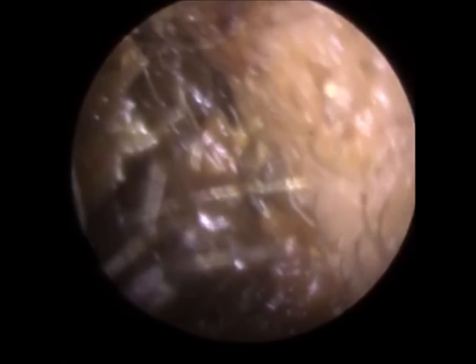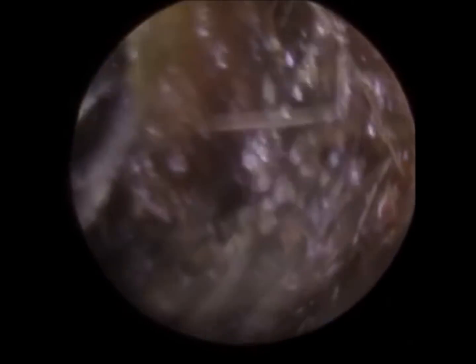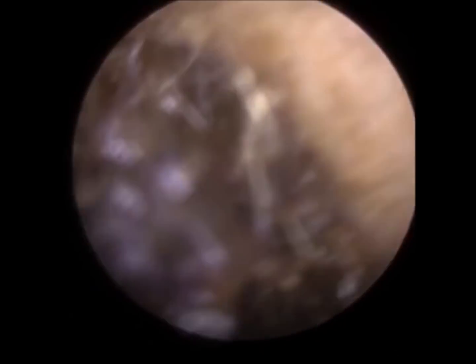We've now gone to the right ear. The patient hadn't been using drops in this ear, and the reason for that is that sometimes when you use earwax drops, the wax absorbs the drops and it expands and swells and creates more of a blockage. Therefore, the patient was very worried that if she put drops in both ears, it would also cause increased deafness in her right ear as well.